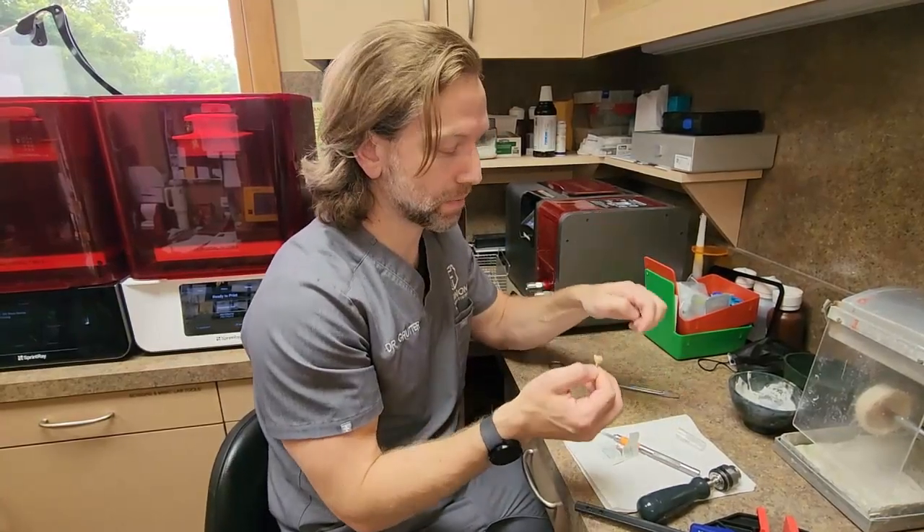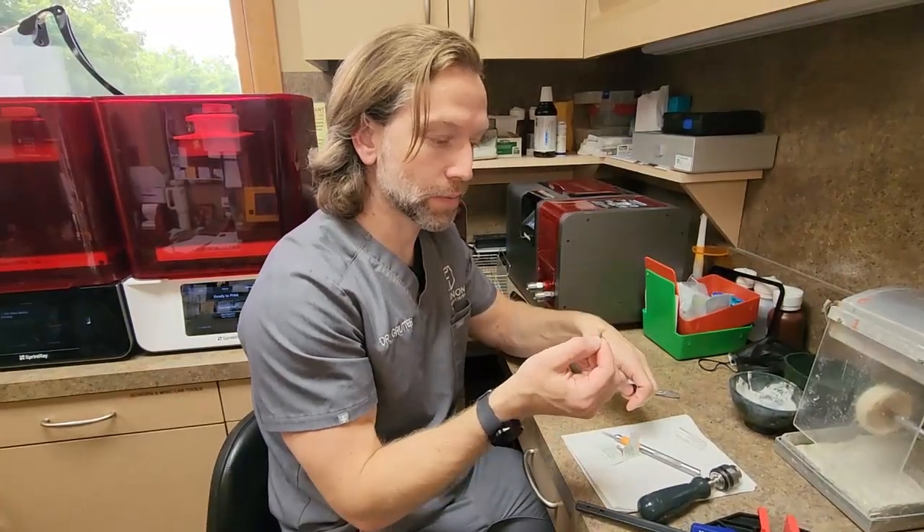So that's how I cement and clean up the cement. It really takes about two minutes of actual total work — a minute up front and a minute at the end. So hopefully that helps.